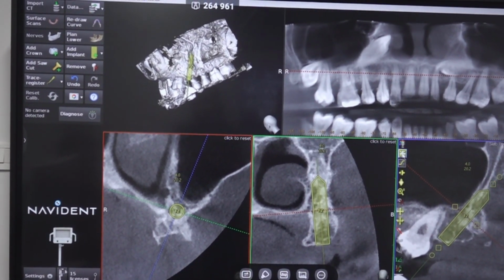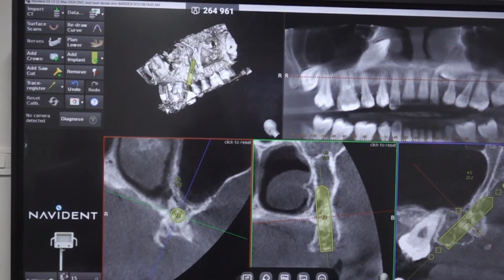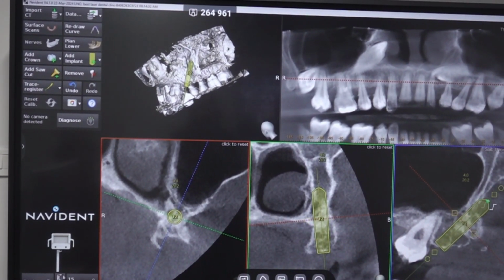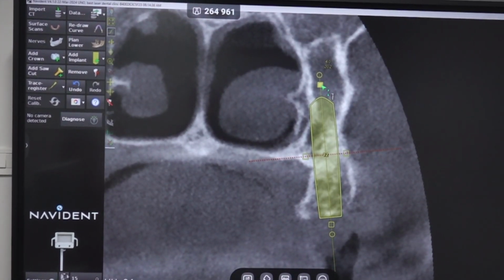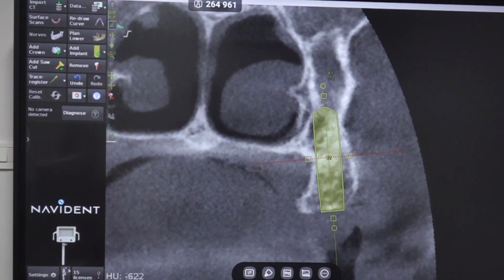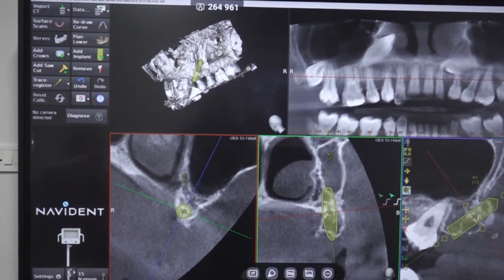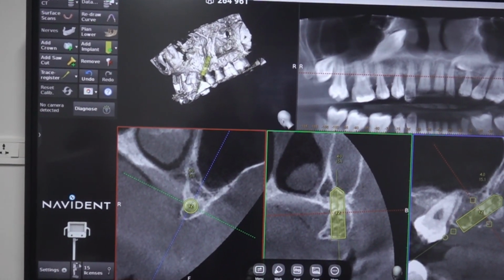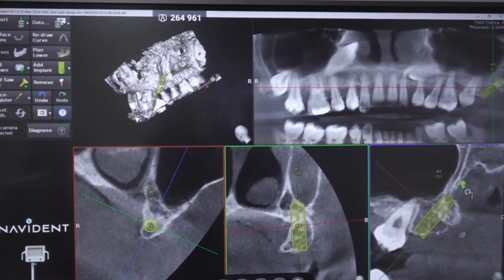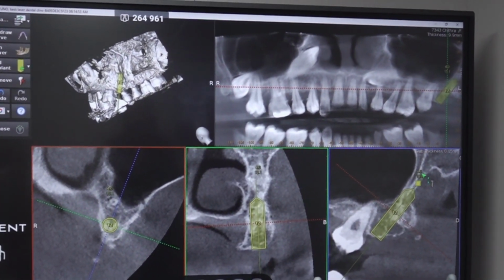What we are going to do is, if we are tilting the implant a little more distally, suddenly the amount of bone available becomes less, right? If you tilt too much, then again it becomes less. So that is the trick here. More horizontal angulation will lead to less available bone. So this is the criteria.